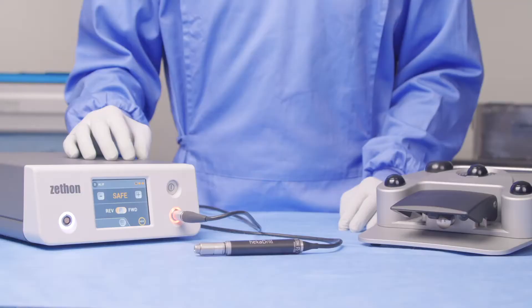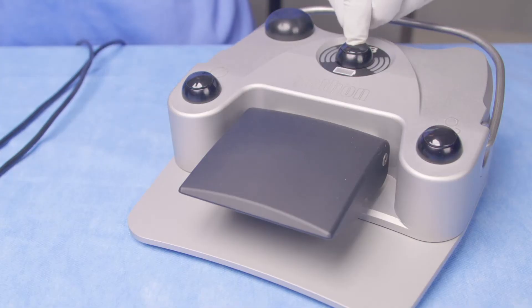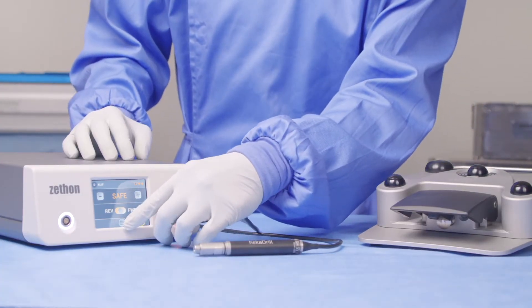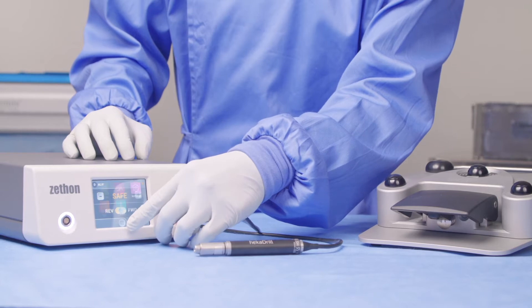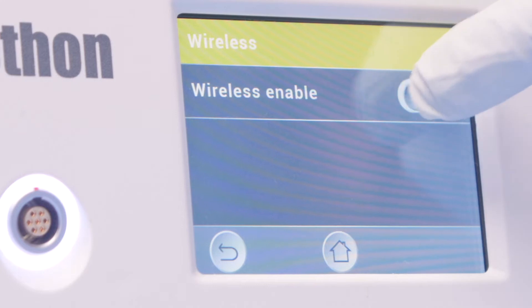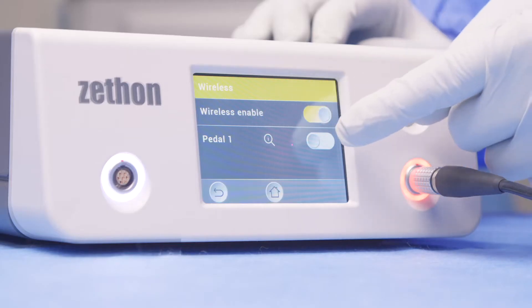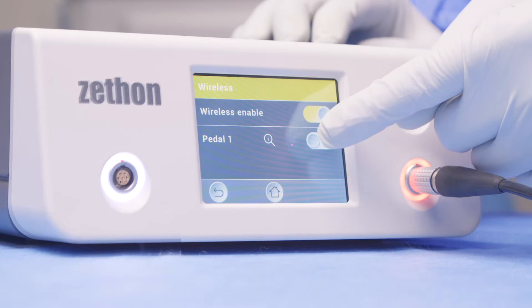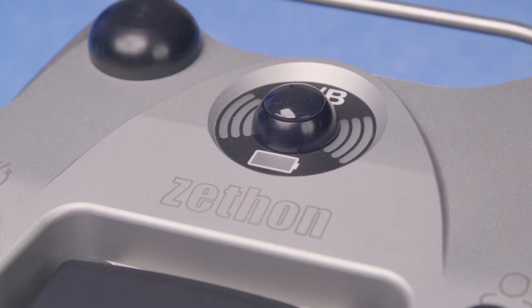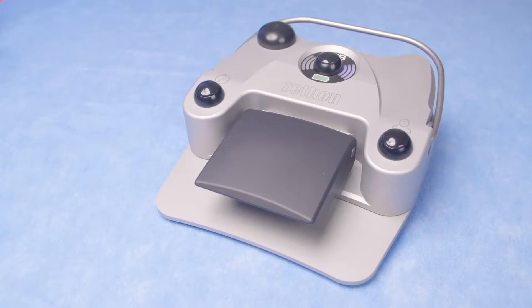The system can use either a corded electric or wireless foot pedal. I'm now going to show you how to connect the wireless pedal. Firstly, turn your pedal on by pressing this central button here. Then go to your menu on the console by pressing this button here and select the wireless tab. Turn your wireless on and select the correct pedal, which will be indicated by a coloured light. You can see that the purple on the console matches the purple on the foot pedal, and once connected the system is ready for use.